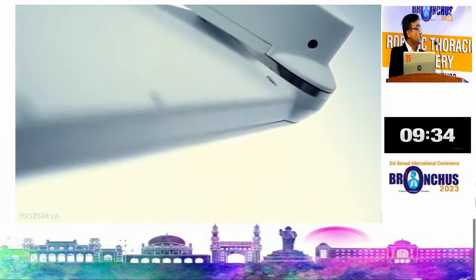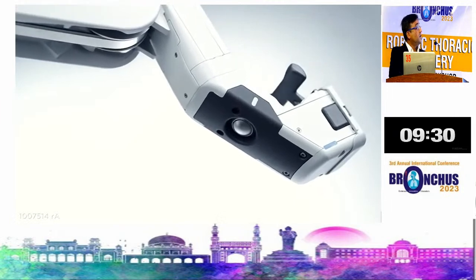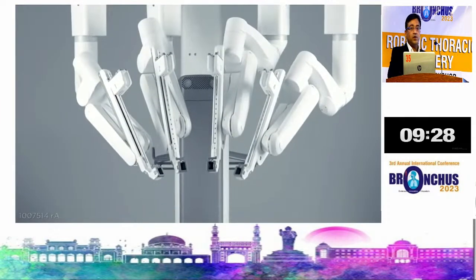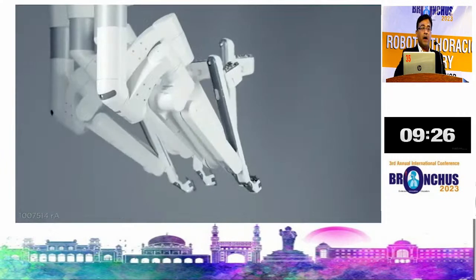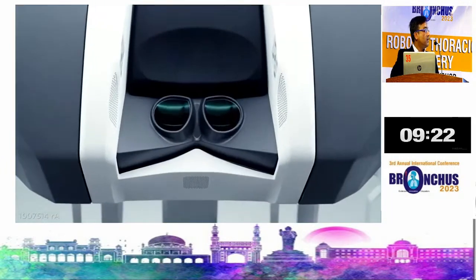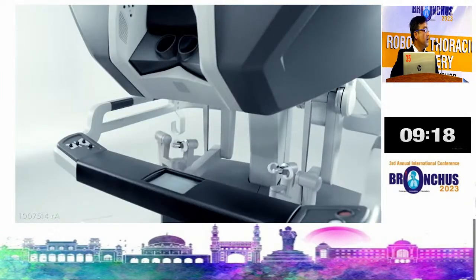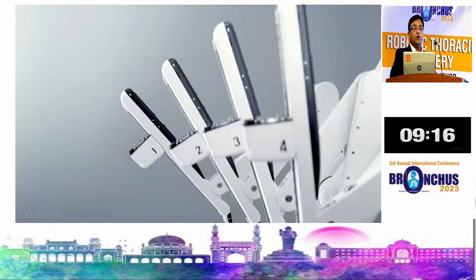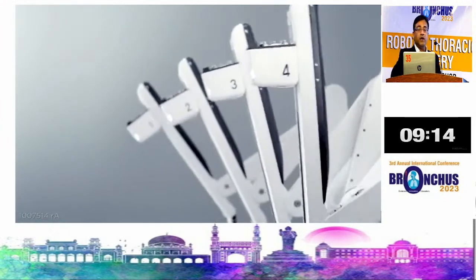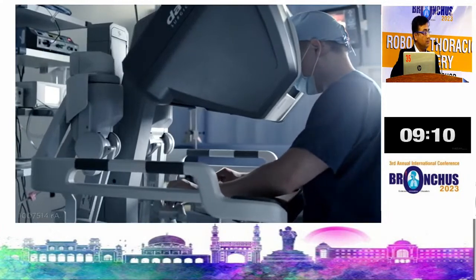This is the Xi patient cart. These are the instrument arms, and all the arms are 8mm arms, which are compatible with 8mm instruments. This is the surgeon console. You see, these are the master controllers through which the surgeon controls the entire robot.